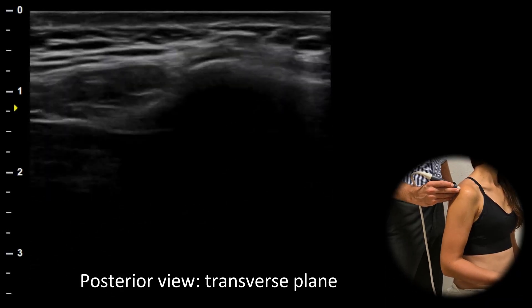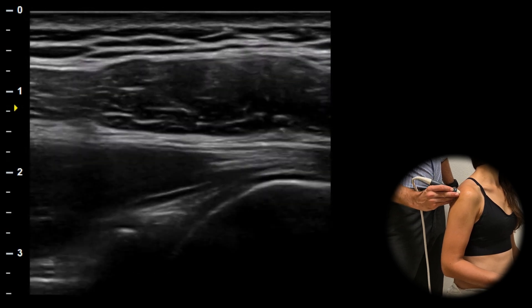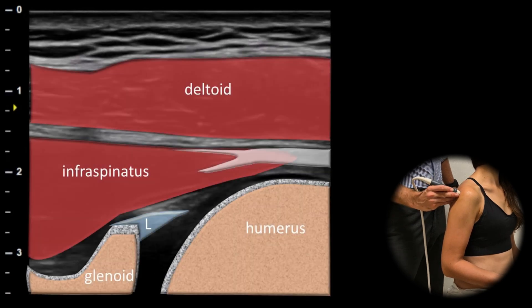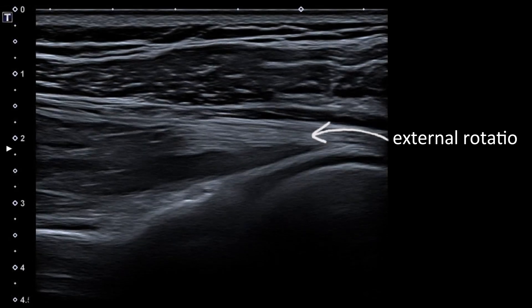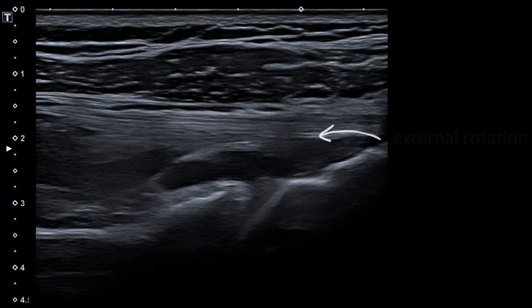When moving to the posterior view in the transverse plane, the second key area to check for effusion is the labrum. Look for anechoic fluid in the joint cavity and consider externally rotating the shoulder for better visualization.